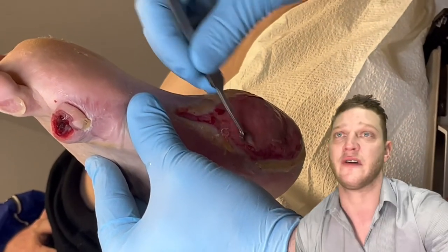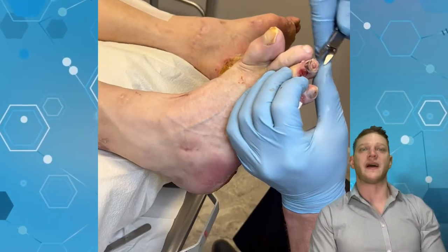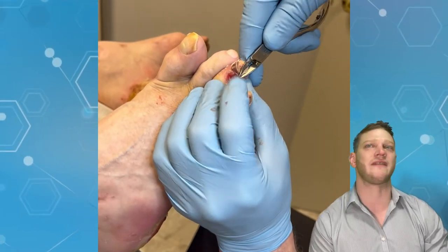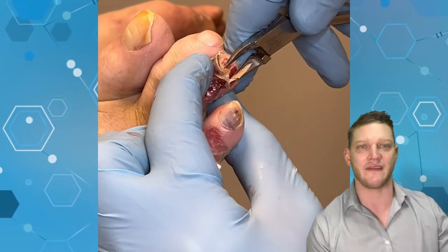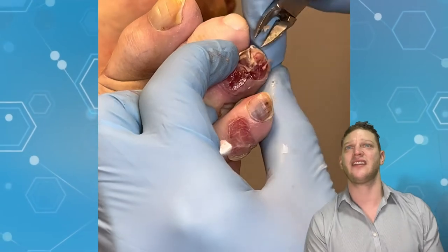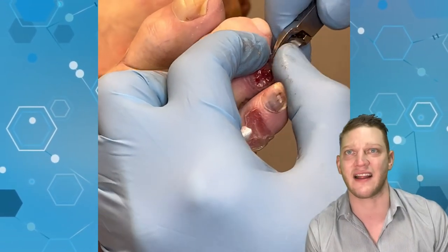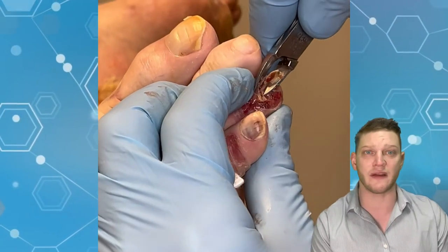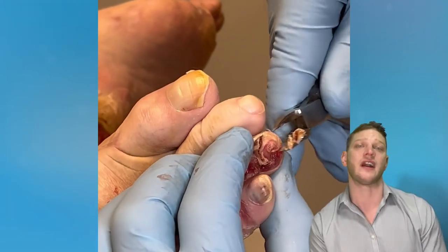Here on the left foot, same old thing — just a regular debridement. Going back to that third toe, I'm using my favorite nippers, my Bianco Brothers nippers — the Excelsior. I'll recommend those nippers any day of the week. I'm removing any of that necrotic tissue: that includes the nail that's barely attached and any of this black tissue that is completely devitalized. All of that has to go. I'm just hoping that after I remove all this dead tissue, I'm not staring at bone.